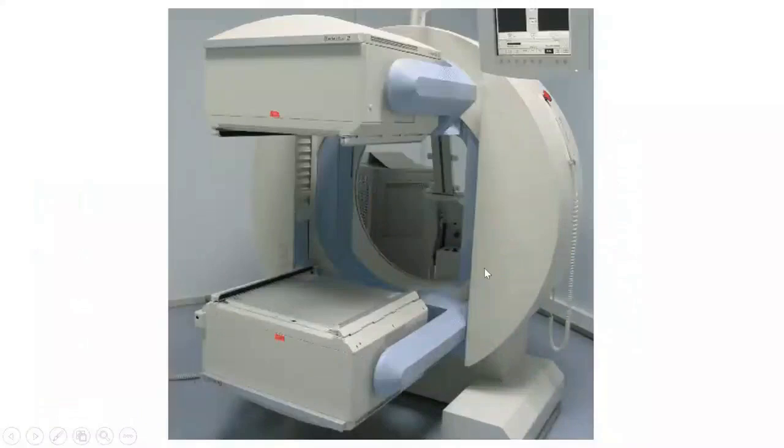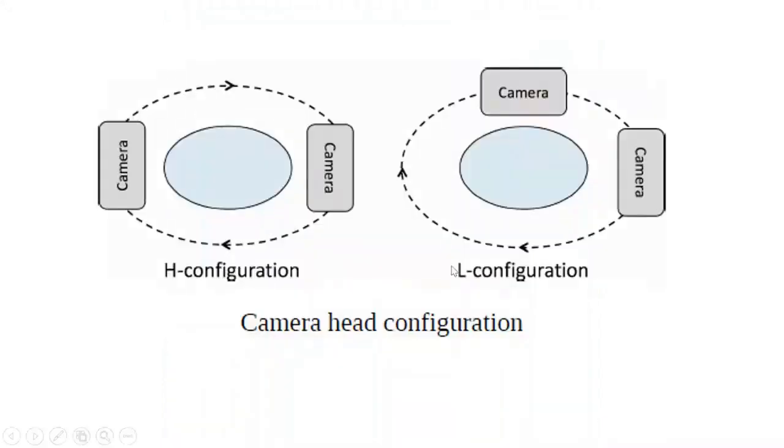The camera is available now, but of course most people think about the idea of saving money, meaning companies come to tell you, for example, that they will give you a dual head, but the price will be very high. So the price for the dual head decreases, especially since the difference is mainly in the acquisition process or time saving. Because of course, if you want to take, for example, anterior posterior views or oblique views for the patient, such as right posterior oblique and left posterior oblique together, or right anterior oblique and left anterior oblique together, then in this case, you can use the dual head to image the patient. This is the idea of the dual head.